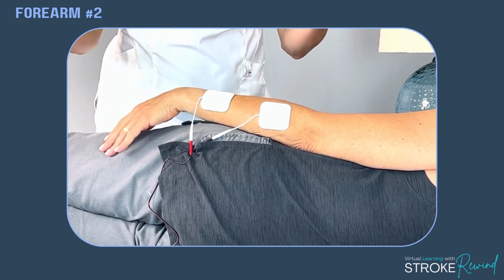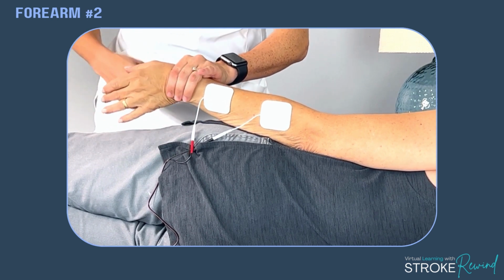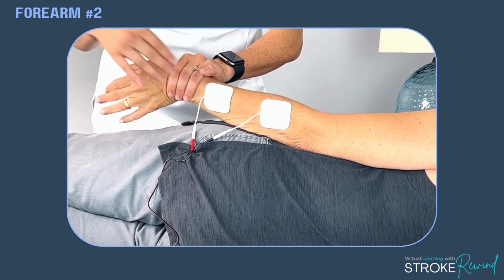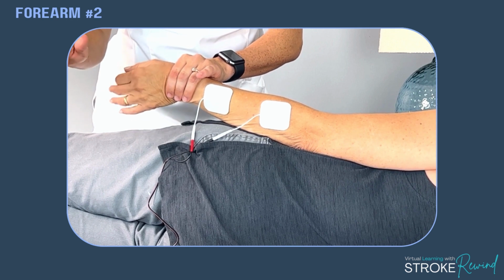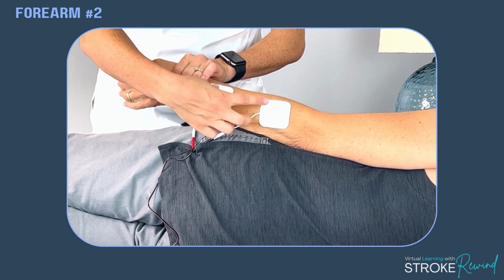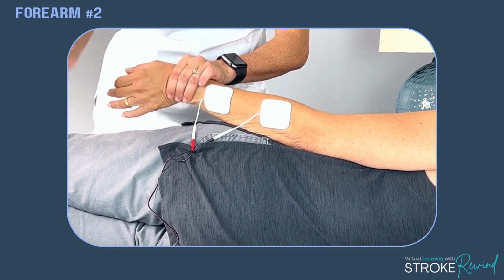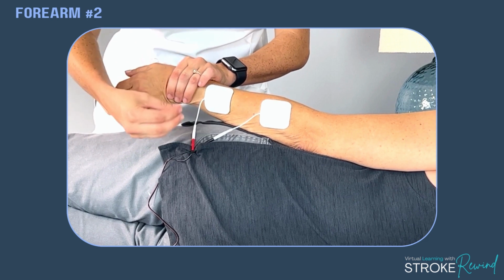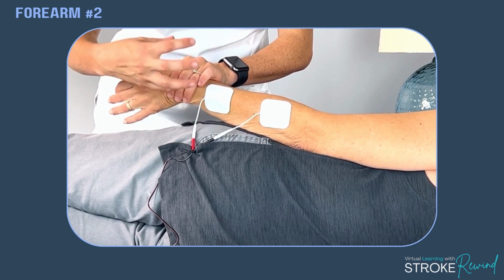Now, if the hand's moving in an awkward position, you can reposition. So like if I hold it like this, you see how the hand's coming back. So this particular placement helps with opening the hand. So if you're having a hard time opening the hand, you're going to do this motion. But again, look at this incredible movement we're getting here. That brain is just getting signal shot up, and it's loving it, and it's going to get that arm moving again. An incredible tool if you're not moving that arm at all.